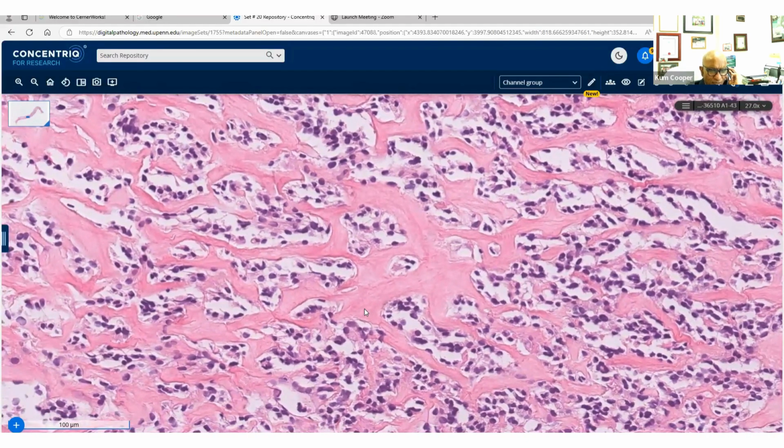And to me, this is very much like that described in AJSP about 12, 15 years ago by Dr. Fletcher, retroperitoneal hyalinizing sclerosing PEComas. So I think that fits, and you're quite right. This is not the classic architecture. You have to think about it and then do the stains. And that's why going through the differential that we talked about is useful to approach these.